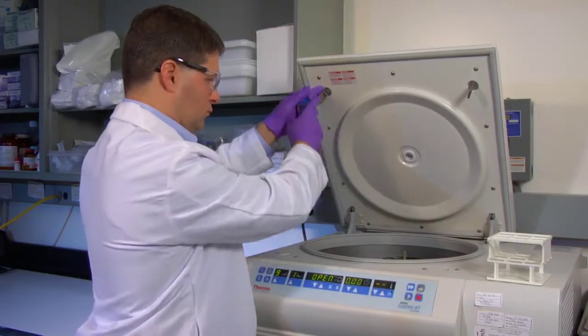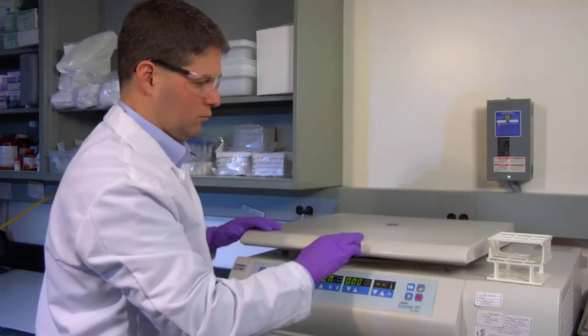Centrifuge the cell suspension at 50 times G in a centrifuge at room temperature for five minutes.